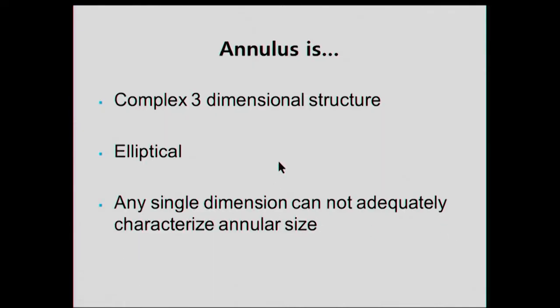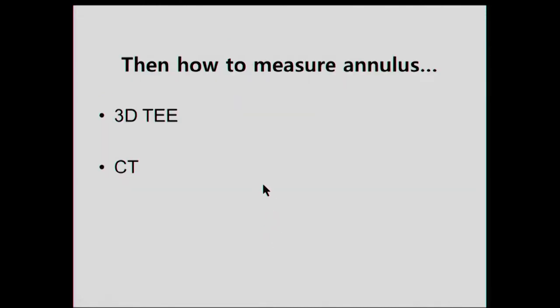That is to say, the annulus is a complex 3-dimensional structure, and it is elliptical in shape, so any single dimension cannot adequately characterize annulus size.